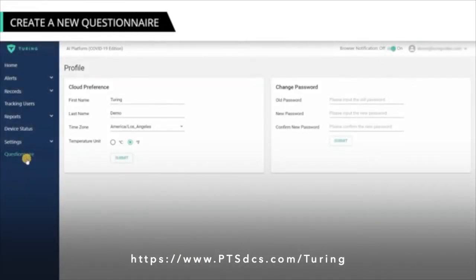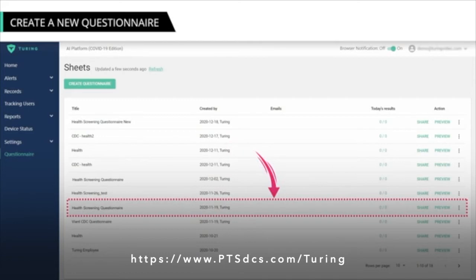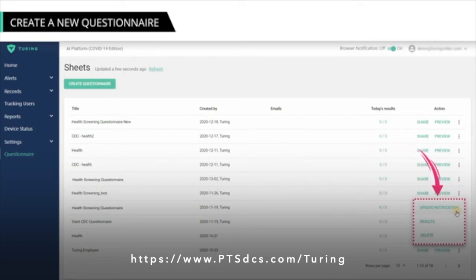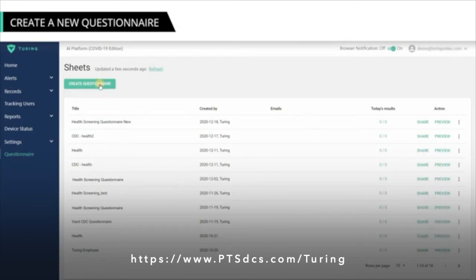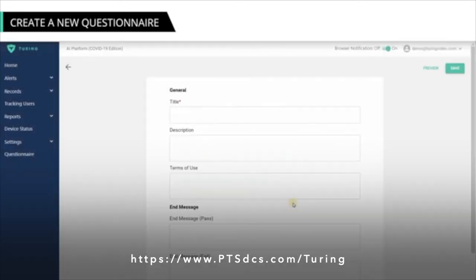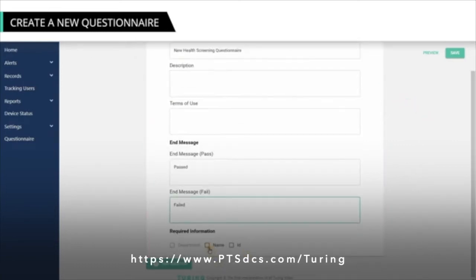When creating a Health Questionnaire for your organization, simply go to the Questionnaire tab on the left menu. A list of existing questionnaire templates appears, arranged by the questionnaire title, creator's name, and the actions you can take for each. You can use the More Options icon to view more actions such as updating a notification, deleting a record, or viewing the results. To create a new Health Questionnaire, click Create Questionnaire. Select the Create from Scratch option in the overlay box, then click Next. In the General form, enter an appropriate title. You also have the option to enter Descriptions, Terms of Use, End Message, Pass, End Message Fail, and whether you want more information from the contact such as department, name, or ID.